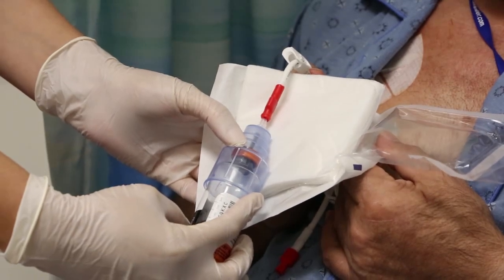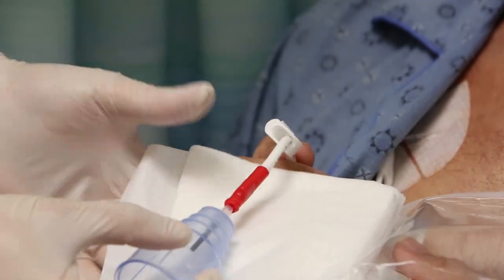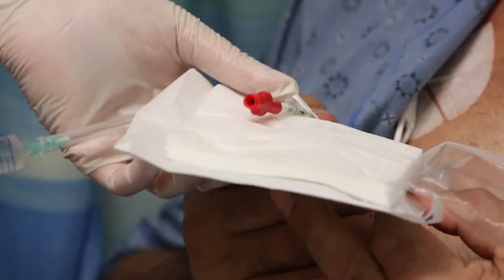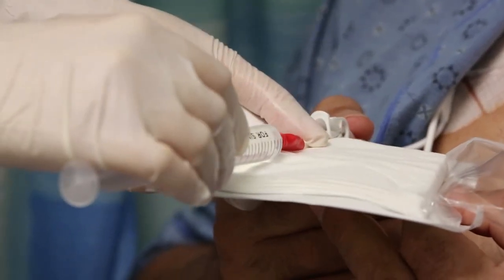Once all the required bottles have been filled with the appropriate volume of blood, reclamp the line and remove the vacutainer and needle from the port. Obtain the syringe prefilled with saline and remove the needle and cover, making sure not to touch the syringe tip.